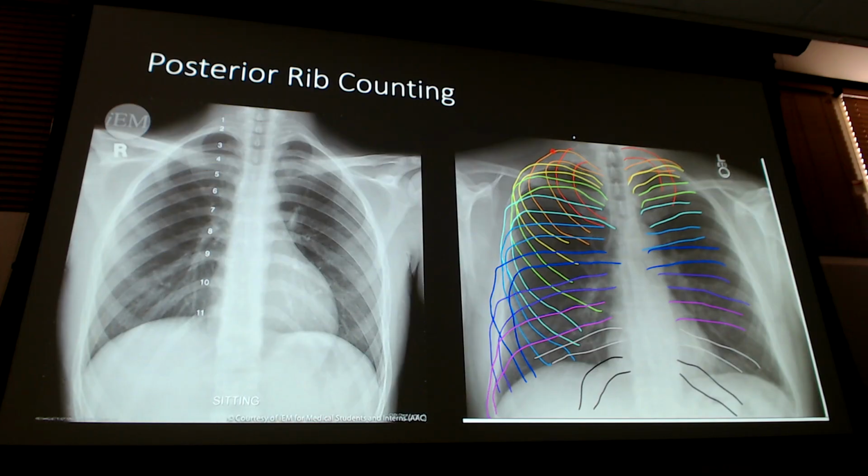Rib counting. Okay. The ribs that come horizontal are your posterior ribs. Let's think about why for a second. How am I doing my x-ray? I'm doing it facing this way. Posteriorly, my ribs are very horizontal right now. So when the x-rays hit, you're getting the horizontal part. The main meat of this rib is what's coming more horizontal. I know it goes down a little bit, but it's more horizontal, right? That's what's projecting there, because it's right here.